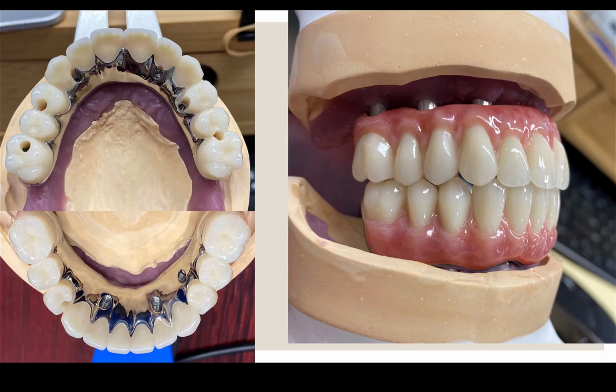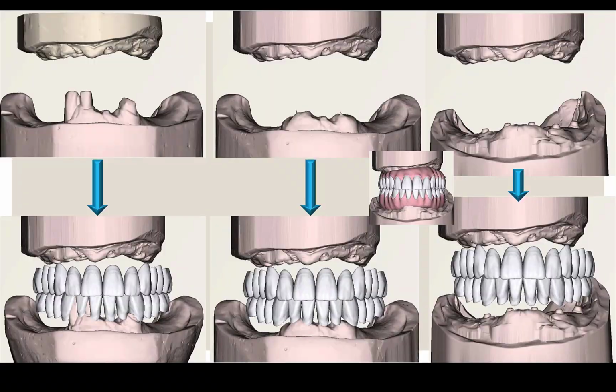Stoneglass has recognized that a critical consideration is that a prosthesis should be designed to be serviceable and maintainable. For fixed cases, unit-built elements with lingual metal buttresses allow forces to be spread throughout the prosthesis. Teeth can be replaced at any time, and sluiceways for cleansability are additionally incorporated because hygiene and soft tissue maintenance is not an option, it's a necessity.